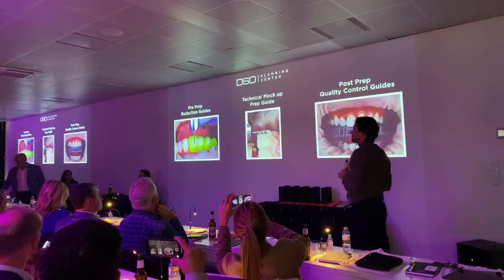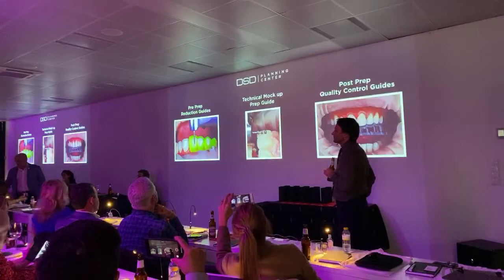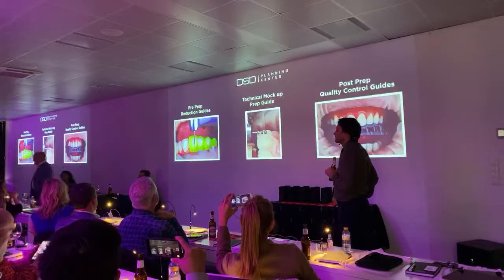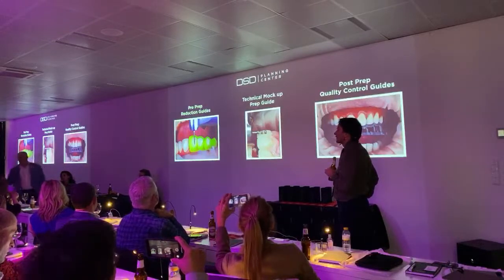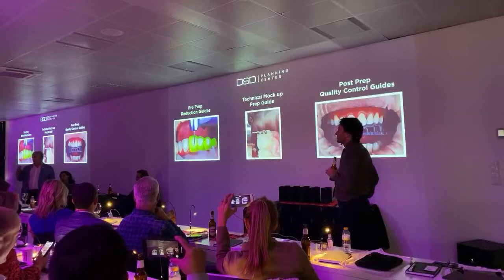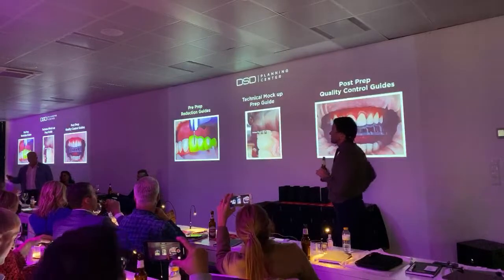But even then, even with this, you're tired and you're working in the mouth all day and you can't see everywhere and there's saliva, etc. Just having that small thing so you don't have to adapt the restoration. So then the ideal is exactly that. So every time we notice that we need to change a little bit the design, yes. I didn't understand the question.